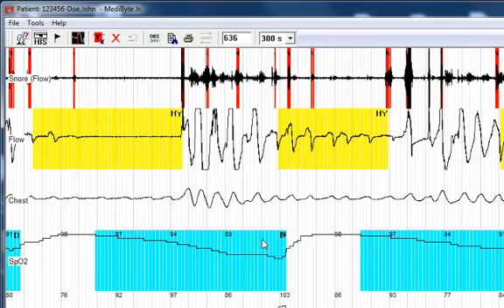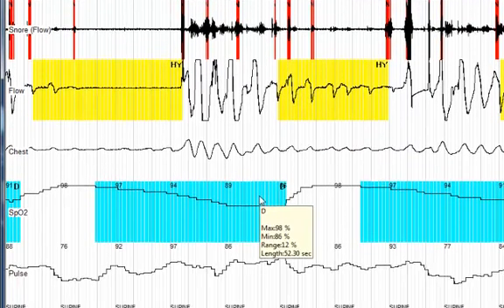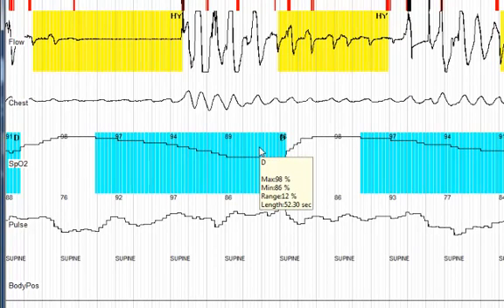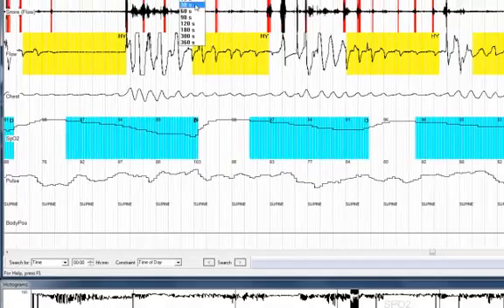And the length in time is 52.3 seconds. You may resize an event by left clicking on the border and moving it to the left or the right.